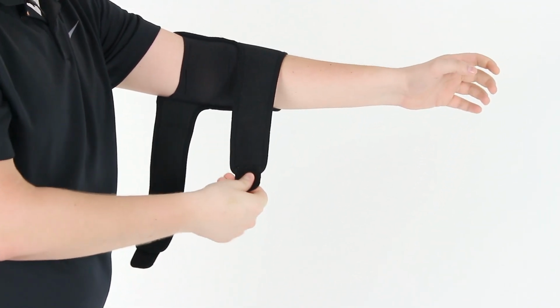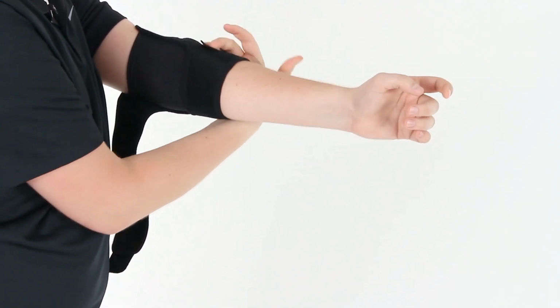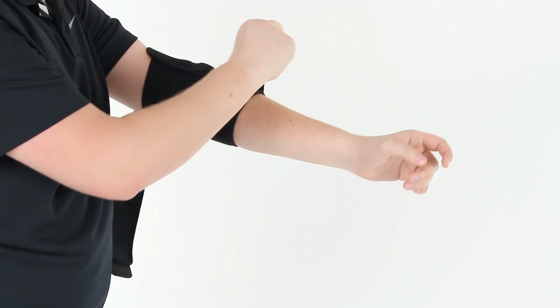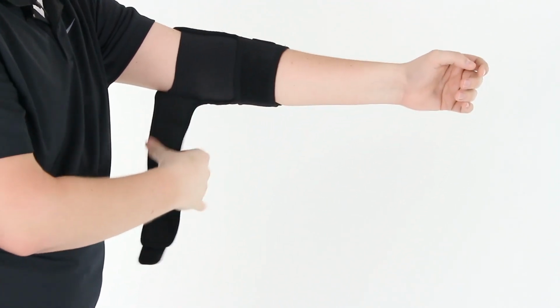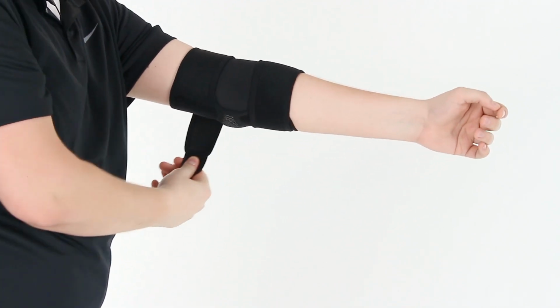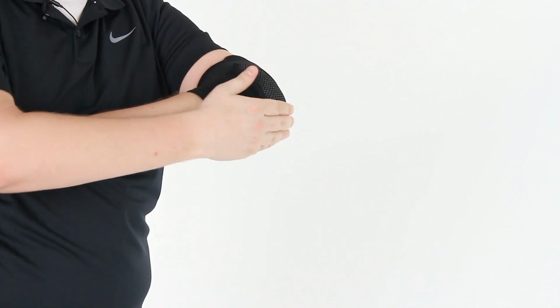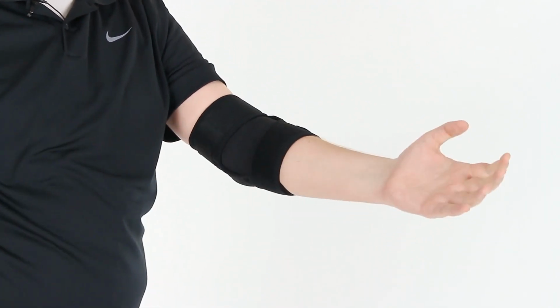From there, wrap the first strap around, secure it to where it's compressive, but it's not uncomfortable. Bring that second strap around, test the fit, make sure your elbow's in the proper place, and you're all set.